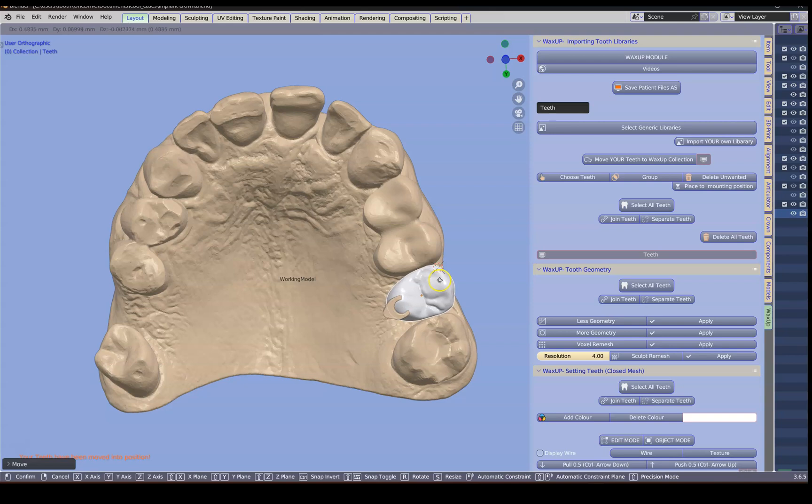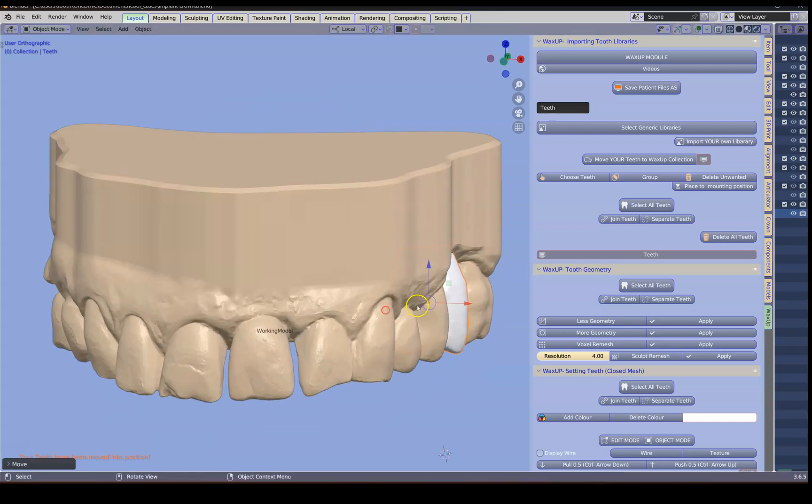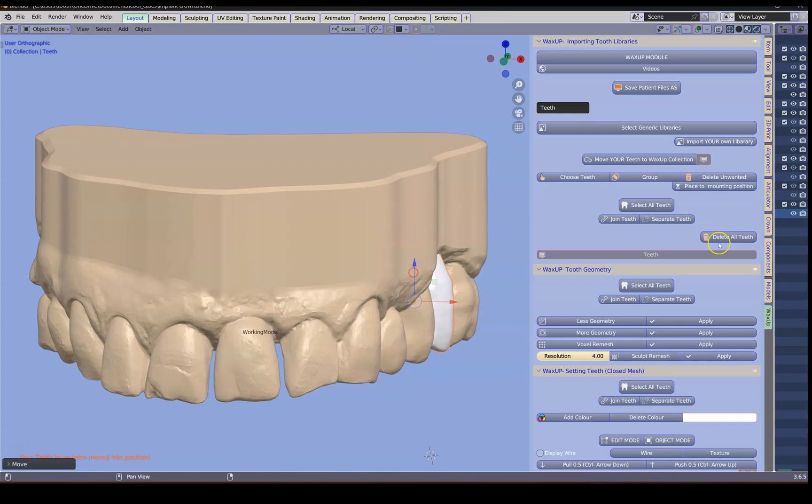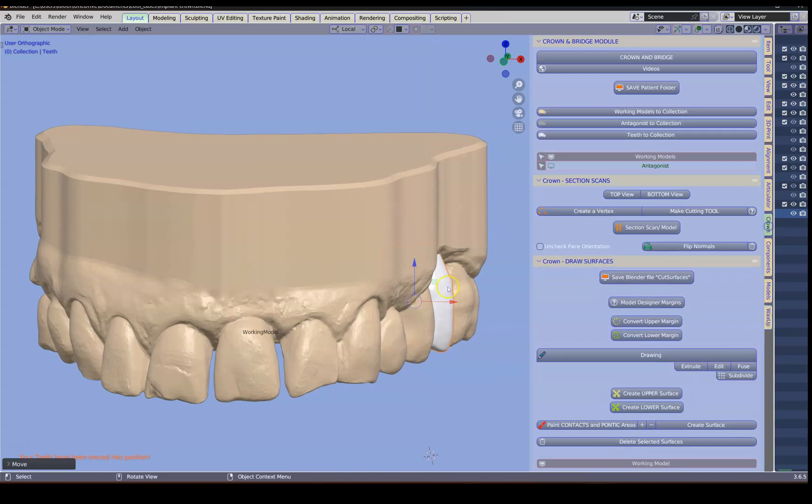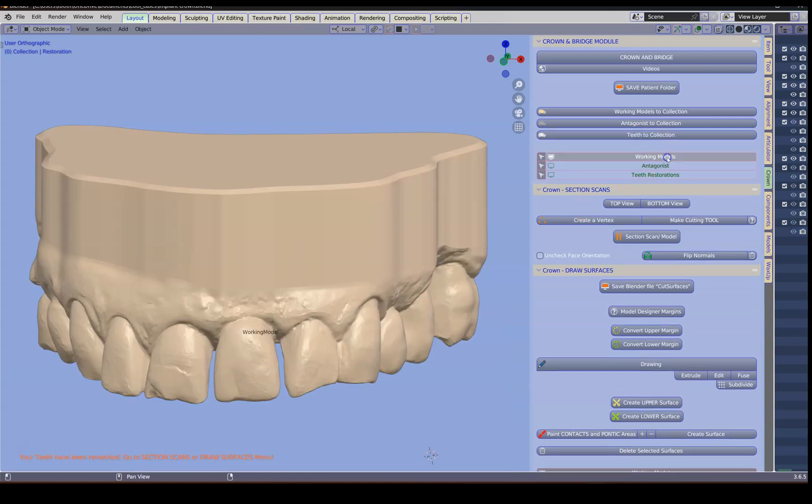Once you're sort of happy with it we're going to put this one into the correct collection in the crown module. Now we have all three objects in the correct collection.